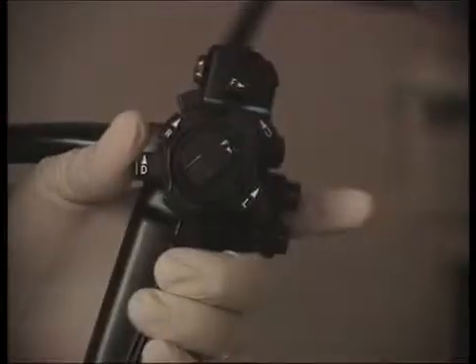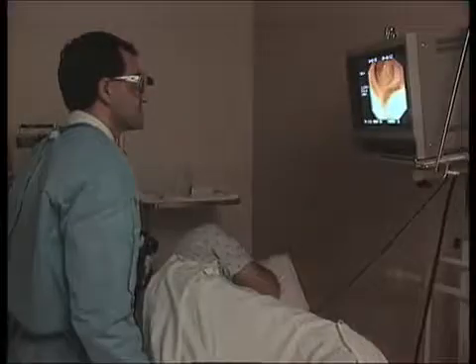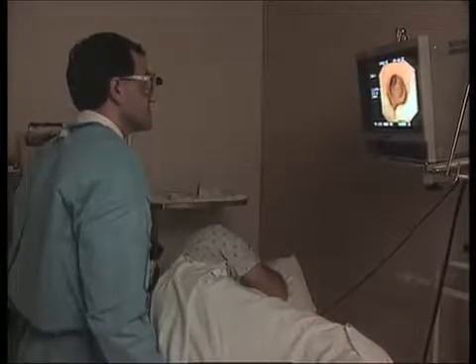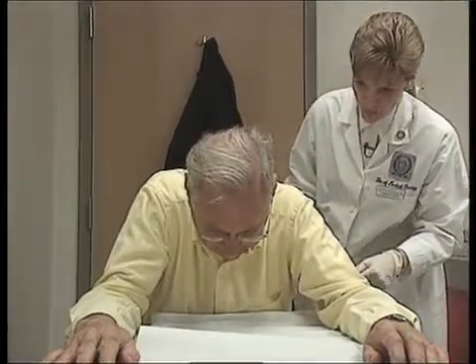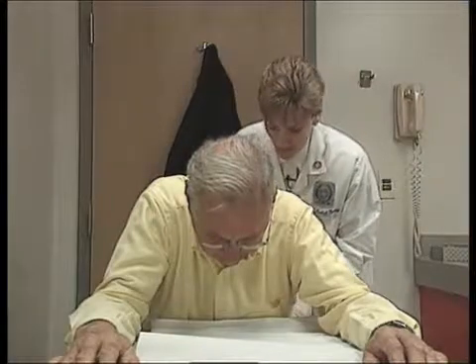Just a little pressure, a little grayish, and I see some red lines which are blood vessels. If you can look at the monitor you can see what the inside of the colon looks like. We're almost as far as we want to go — we're going to start coming back right now. So a little discomfort here as we're getting around. Okay sir, I'm going to remove my finger now.